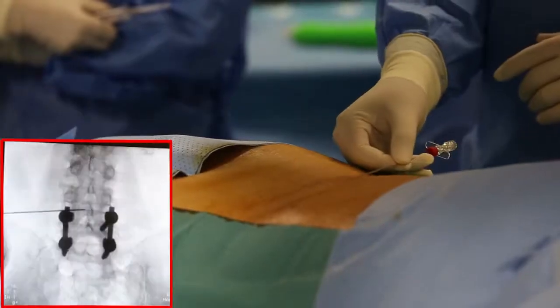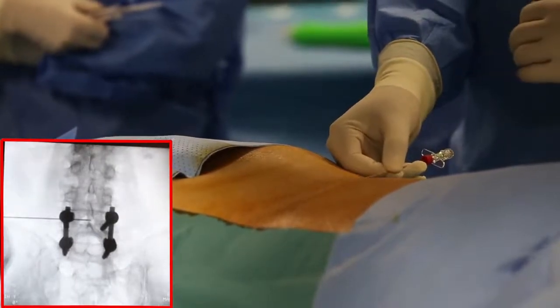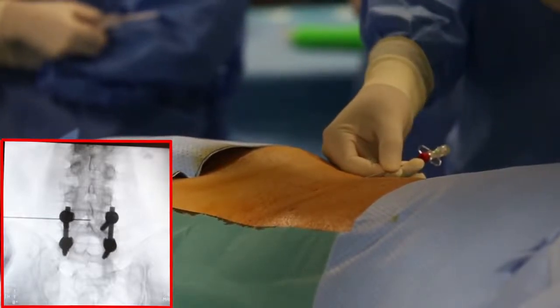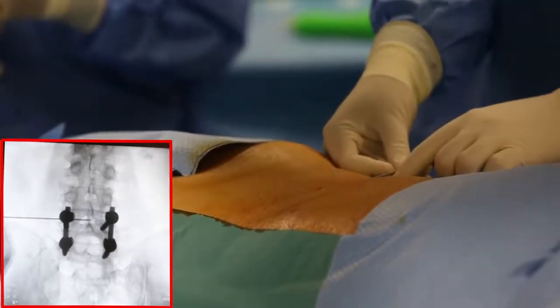Obtain an anterior-posterior projection, check the monitor and go to the exact level of the disc to be treated. The previous spinal fusion procedure was performed at L5 S1 level, whereas we need to treat the L4 L5 disc above.